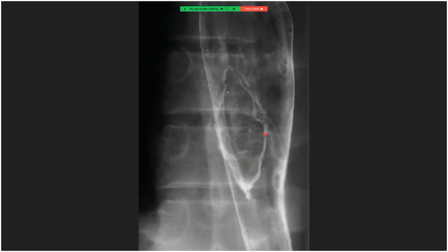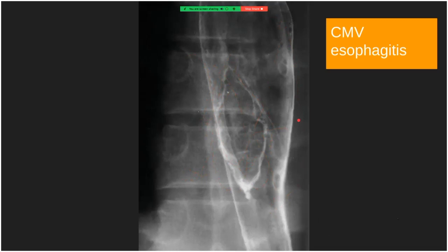In contrast to the prior case with small ulcers, this example shows a large shallow diamond-shaped ulcer. For reference, an adult vertebral body height is approximately 2.5 cm, so this ulcer spans roughly two vertebral bodies. The surrounding mucosa is normal. This finding is consistent with CMV esophagitis, and a history of poorly controlled HIV infection is typically given. Treatment for CMV esophagitis is ganciclovir; however, due to ganciclovir's high toxicity, the diagnosis must be confirmed by brushing or biopsy of the ulcer before administering treatment.